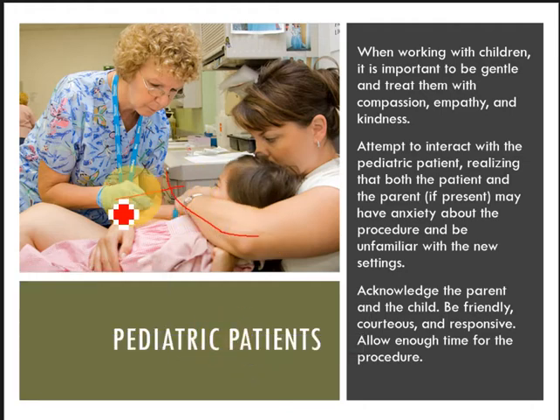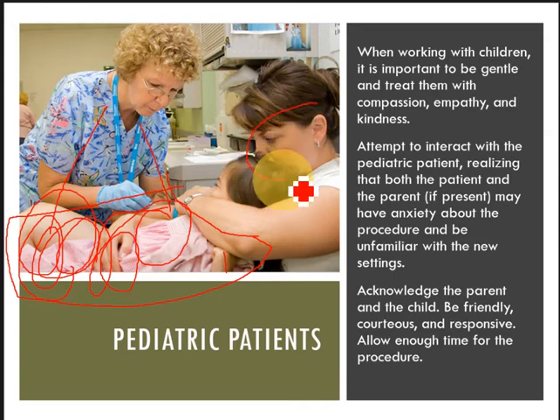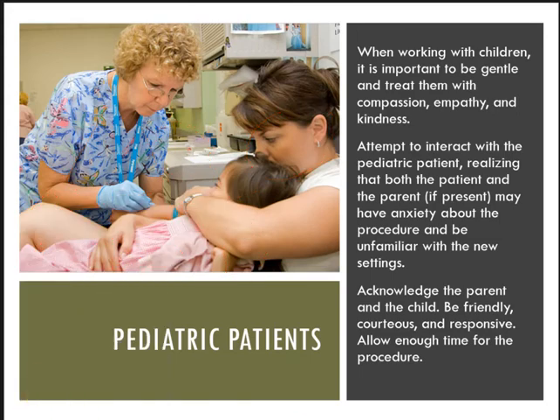All you have to do is wrap this kid with a blanket. Okay, securely wrap this child with a blanket, covering his or her extremities, so that he or she will not be able to punch you, kick you. Okay, and then also, as much as possible, let the parent or the relative hold his or her mouth to avoid spitting on you. Okay, and then, as much as possible, grip the hand of the patient as strongly as possible, pero ayaw po nang ma-break ilahang wrists. Okay, nang igo lang jud na pagtusok nimo, dili nila ma-pull back ilahang kamot. Okay, so that's it for our pediatric patients.